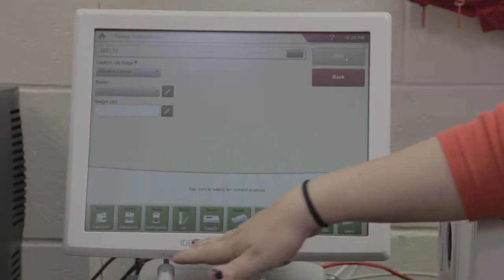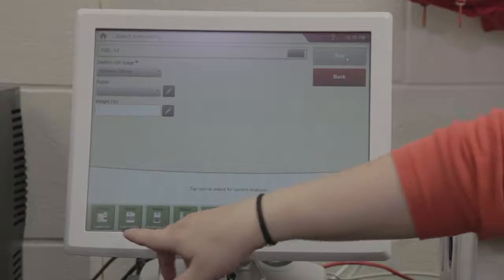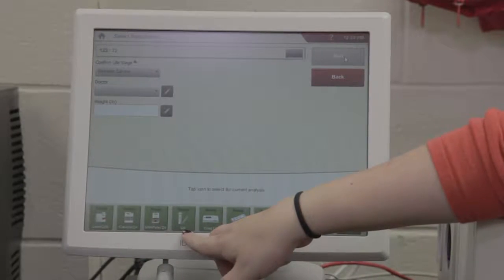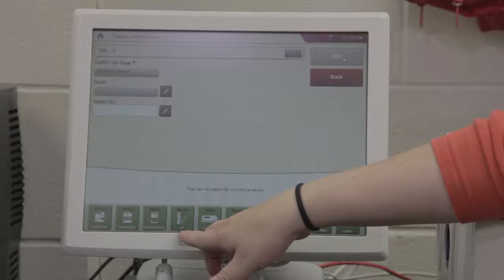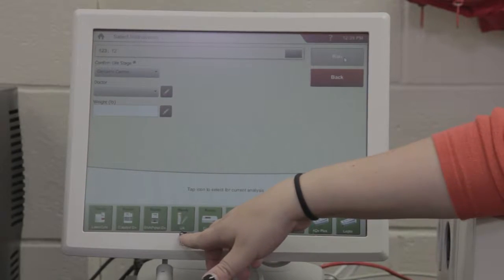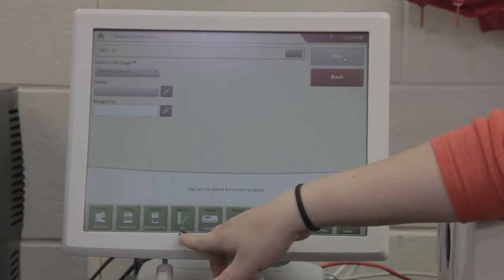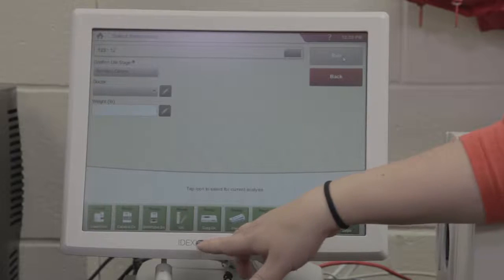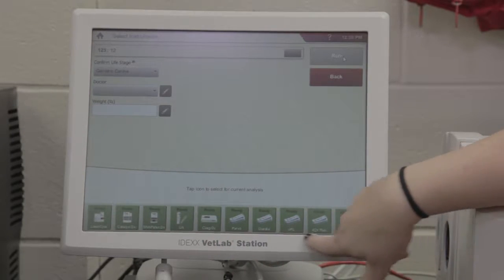Down here at the bottom, we have all sorts of green icons. So you'll notice we have our LaserCyte icon, our Catalyst, SNAPshot. We have a new icon that came out with just our newest release, which is the UA icon, which would allow you to enter your UA strip results into the analyzer and have them flow back into AVImark as well. Also, your specific gravity would be captured here. Your COAG, and then you have all of your snap tests.